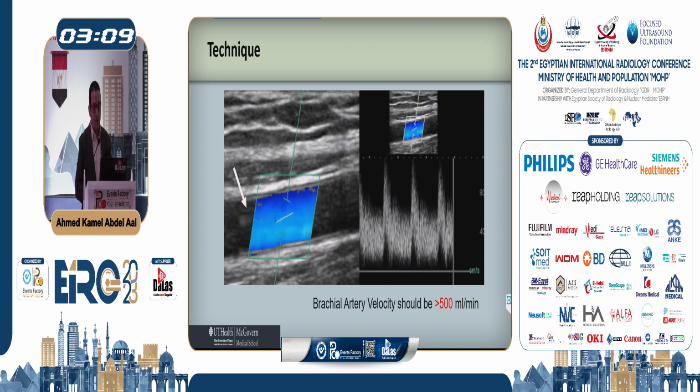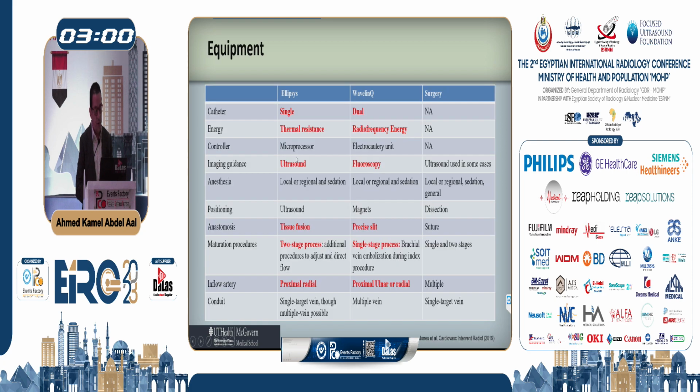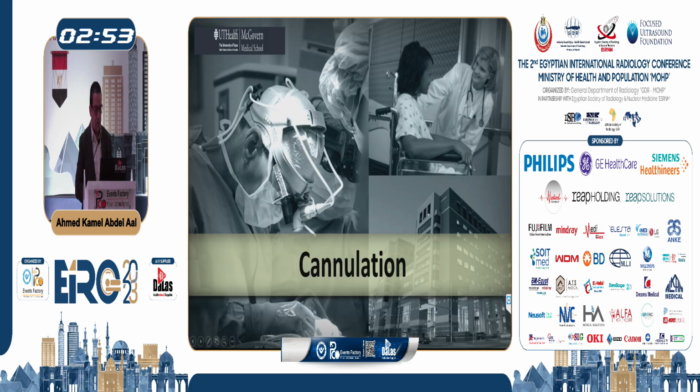It's associated with good maturation of the fistula. If not, then you can balloon dilate that with a 5 millimeter semi-compliant balloon. This is just, again, what we talked about, the difference between the two devices, so we're going to skip that because we talked about all these items.